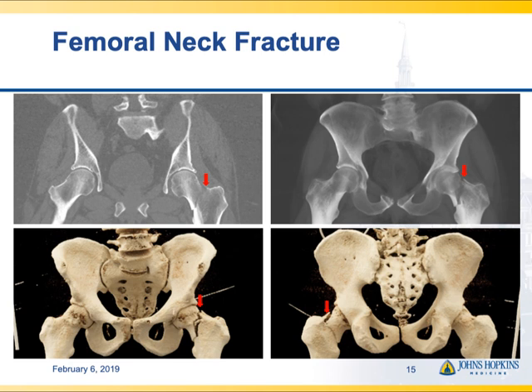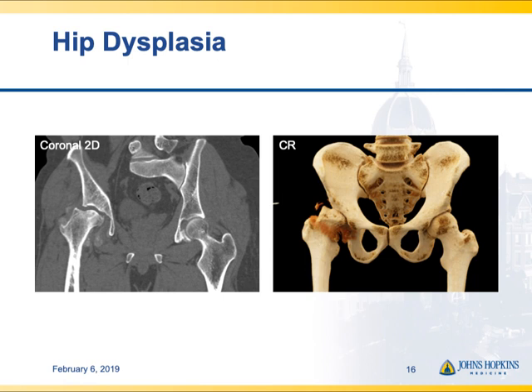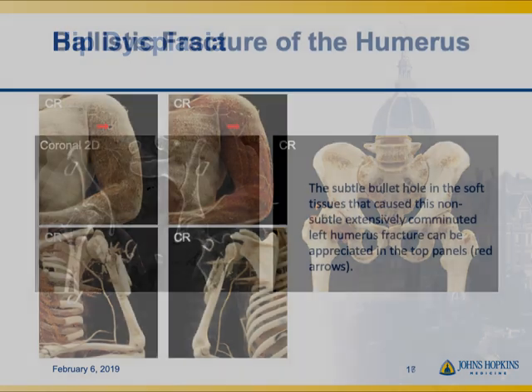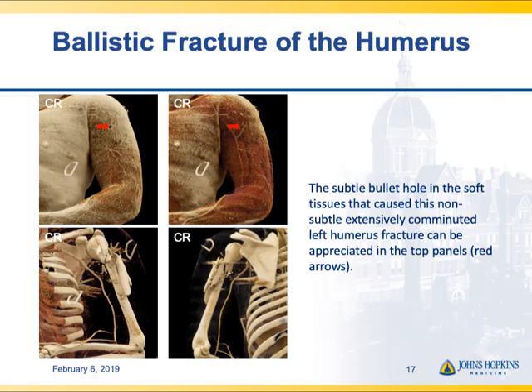Here's a femoral neck fracture, maybe a little subtle on 2D but showing up well in the volume rendered and cinematic rendered images. And here's hip dysplasia — the 2D images show the dysplastic right femoral head and acetabulum, but how those structures really fit together is much better shown with the depth you get from the cinematic rendered image.